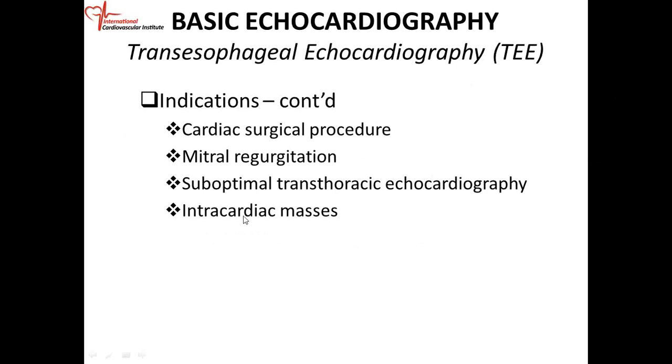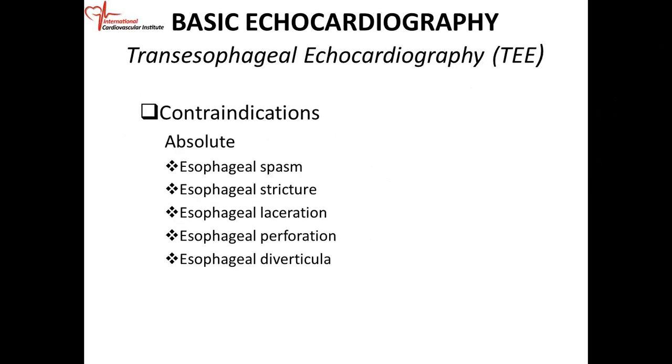Intracardiac masses, such as a left atrial myxoma, or if you think the patient has a clot or any type of mass in the cardiac chambers, then a transesophageal echo is indicated. So those are some of the more common indications for doing a transesophageal echo.